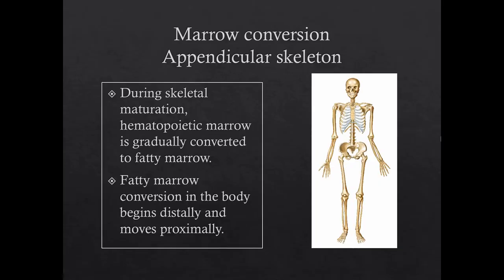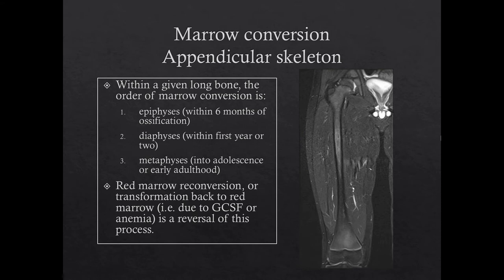During maturation, hematopoietic marrow is gradually converted to fatty marrow. In the appendicular skeleton, this process begins distally and moves proximally, so the phalanges are the first to convert and the proximal hips and femurs are the last. Within any given tubular bone, there is also a specific order: first, the epiphyses convert to fatty marrow within six months of ossifying; second, the diaphyses convert, usually within the first year or two of life; and last, the metaphyses convert gradually up into adolescence or even adulthood.